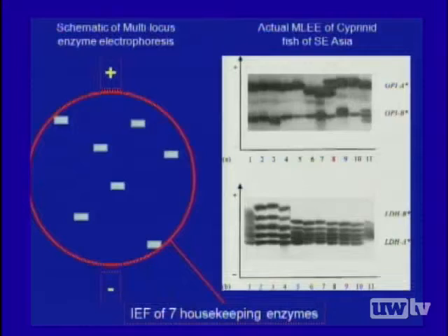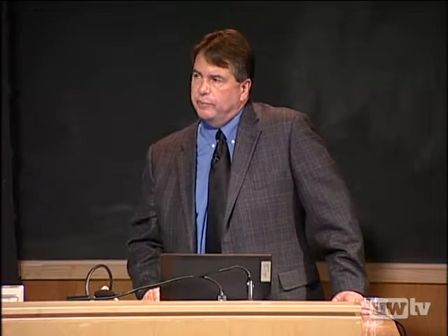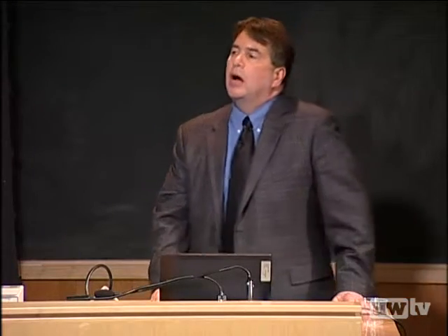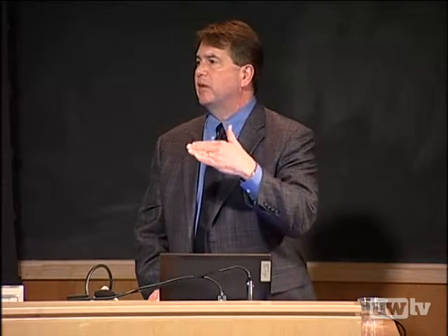And if there is a significant change in one of those proteins, meaning that a positive amino acid goes to a neutral amino acid or to a negative amino acid, then that isoelectric point is going to change, and you're therefore going to have a different fingerprint. As you can imagine, though, as you all remember from your basic genetics, you can have a lot of wobble in the third base of the codon and still end up with the same amino acid. You can end up with a two base change in a codon, and you're going to end up possibly with one positive amino acid just replacing another positive amino acid. So no net change, and it's still going to come out to the same place in terms of the pattern.